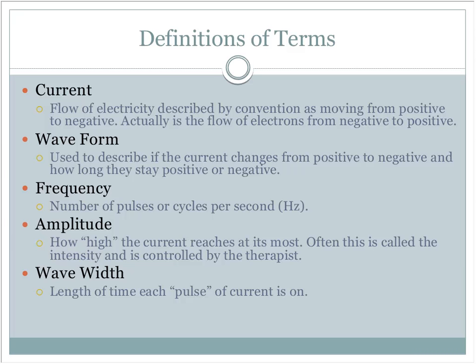So if you go back to frequency, you've got pulses per second. Each one of those pulses is measured in fractions of a second. A lot of times you'll see nanoseconds or microseconds for each pulse. So you think about a second as, you know, broken into 100 units.